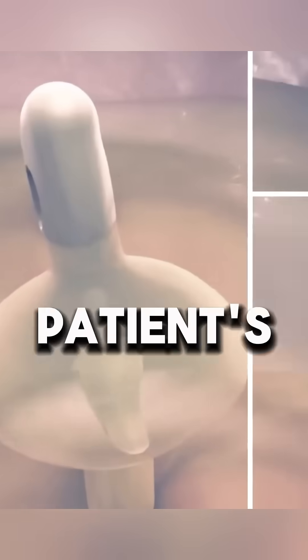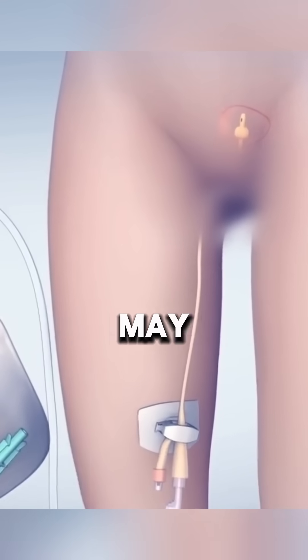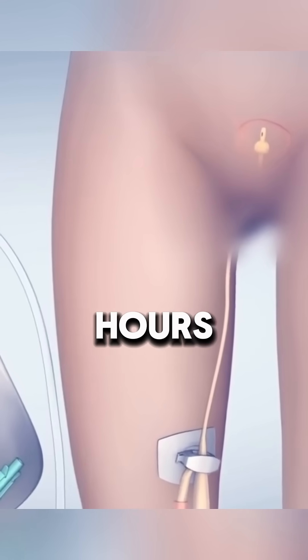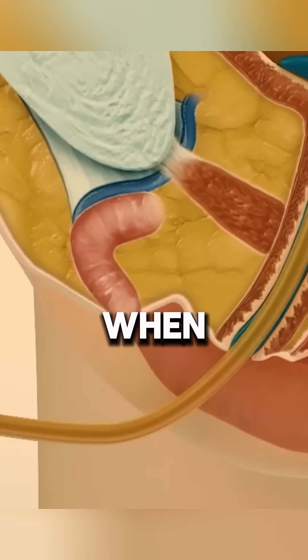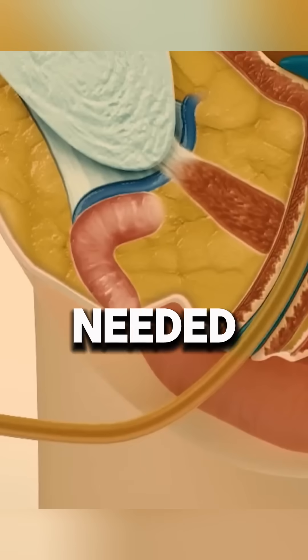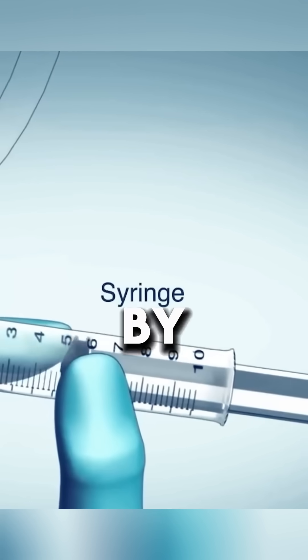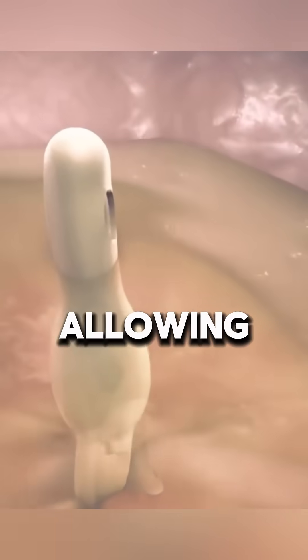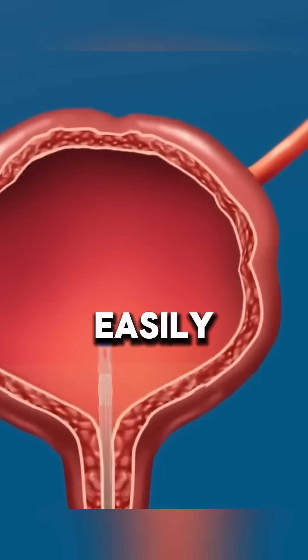Depending on the patient's condition, the catheter may remain in place for a few hours or even months. When removal is needed, the balloon is deflated by withdrawing the water, allowing the catheter to be taken out easily.